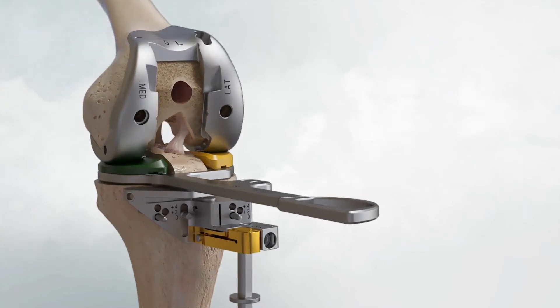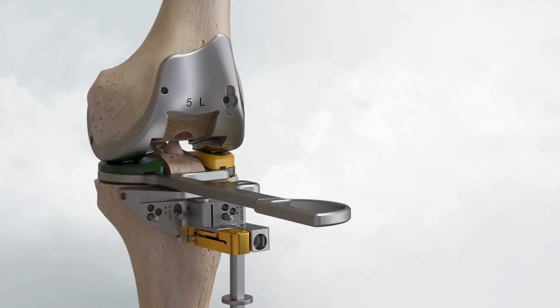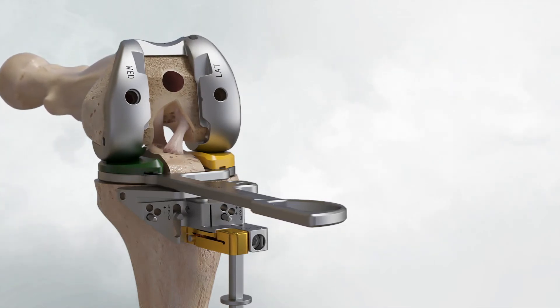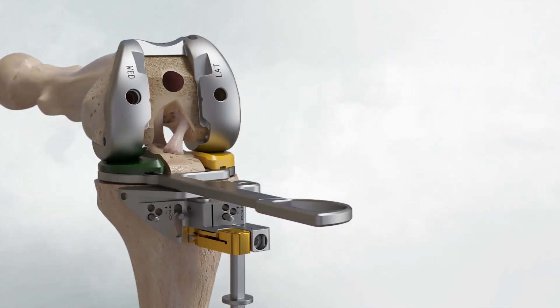Flex and extend the knee, checking for femoral implant impingement on the ACL or tibial eminence. Adjust the femoral trial medial-lateral position if necessary and pin the trial.